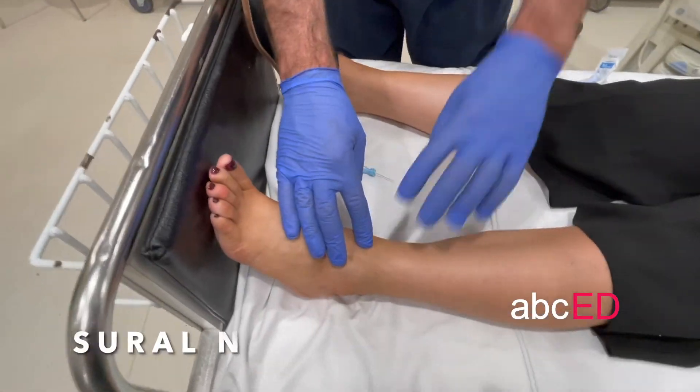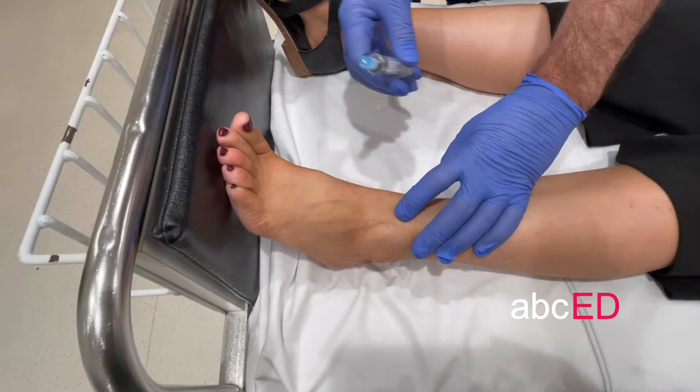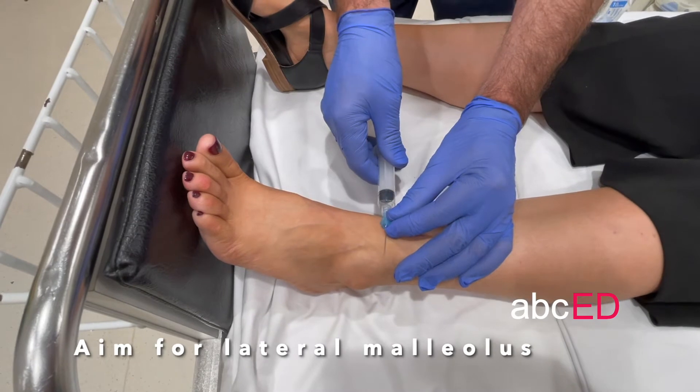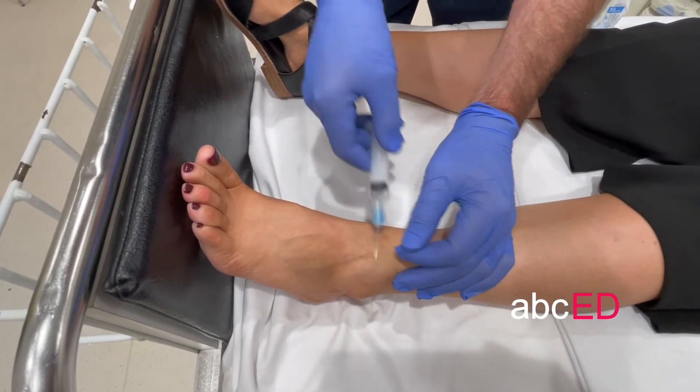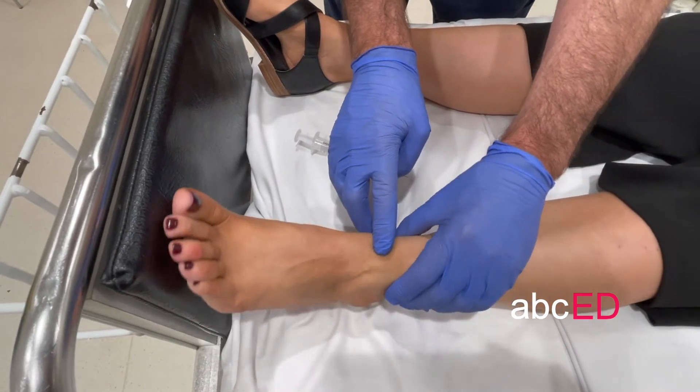The sural nerve block, which blocks the lateral foot — inject another five mils heading towards the lateral malleolus. So essentially you start here and you move all the way across just above the malleolus.